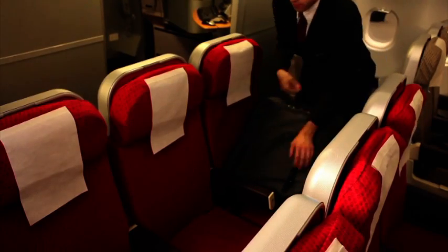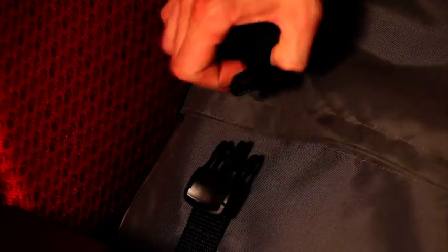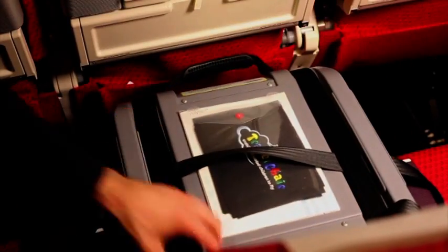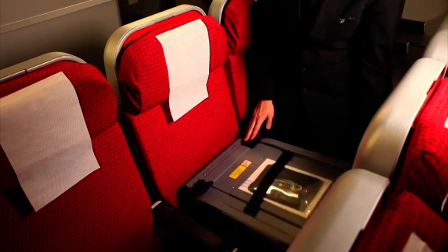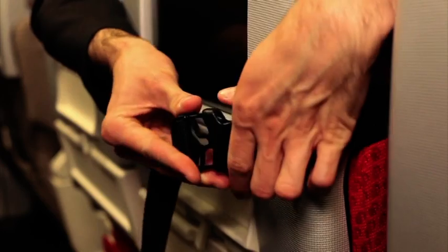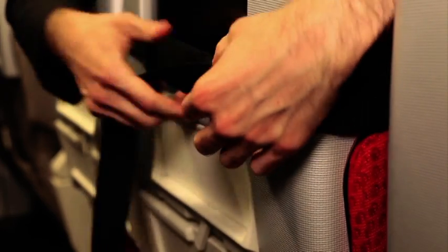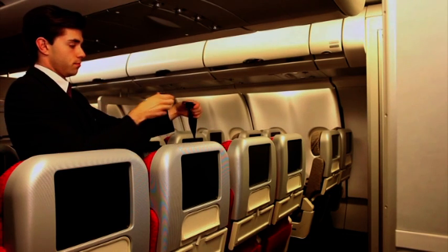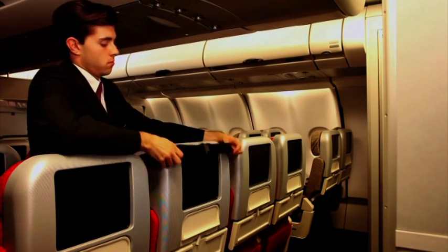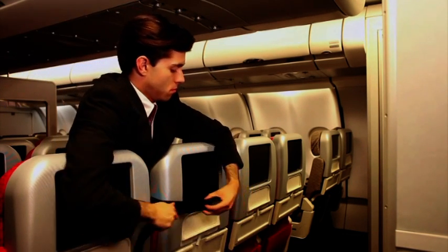To prepare the Travel Chair for passenger use, remove it from its protective storage bag and place it on the aircraft seat selected. Unclip the security strap and open up the chair. Pass the securing straps of the Travel Chair around the back of the host seat and connect. Ensure that any excess strap is secured in the clip provided. For some aircraft seats, it may be easier to connect the securing strap first and then slip it over the back of the host seat and tighten.